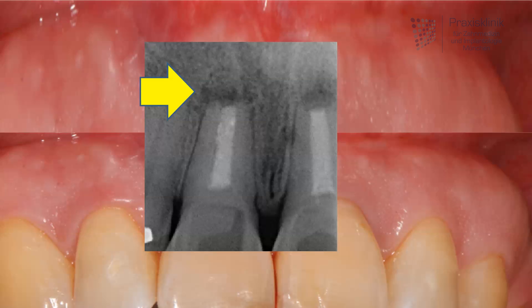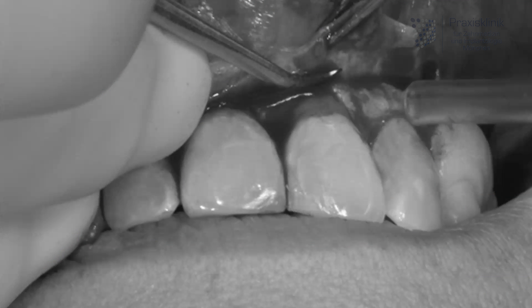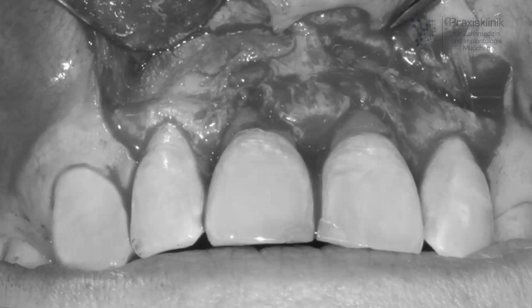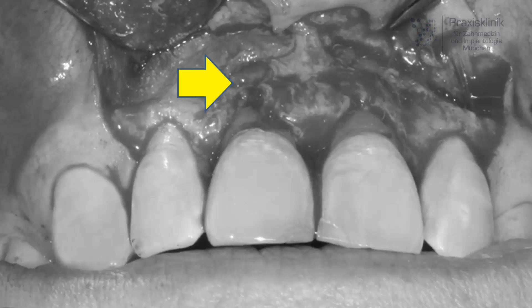You will see in the operation that we do a local anesthetic and lift the gums from the residual bone, as you can see here in that picture. Then we get to the inflammation — it is a little bit difficult to see, but you will be able to see better once we clean it up. The inflammation is indicated here with a small yellow arrow.